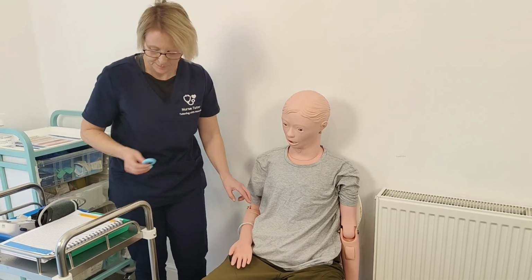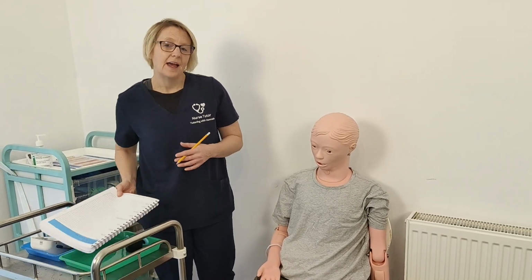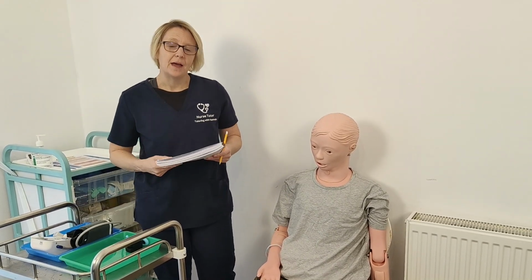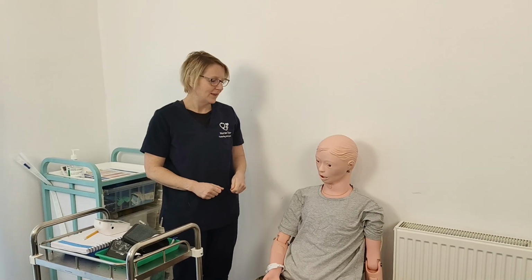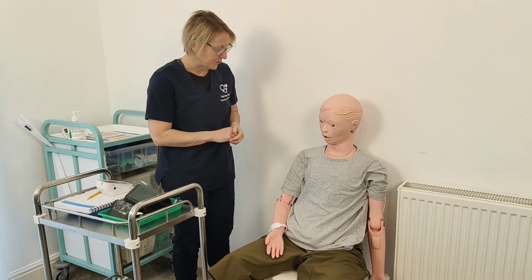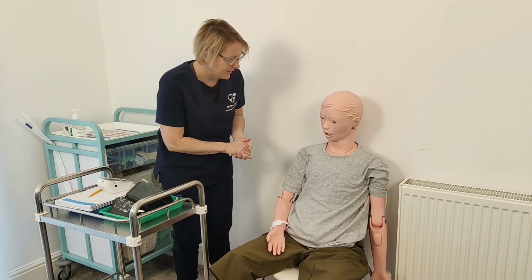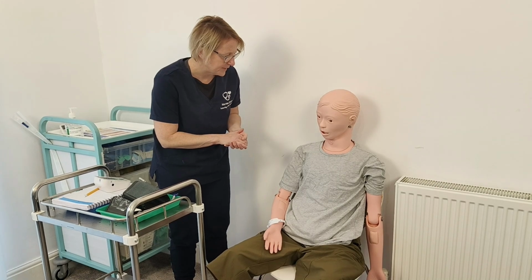My 60 seconds has passed, and the pulse rate was 75, and the rhythm was regular, and the strength was a little bit weak. Now Rose, I'd like to record your blood pressure, so I need to put the blood pressure cuff onto your arm. Are you happy if I use this right arm? Have you had any surgery to this arm, or have you had any fistulas?